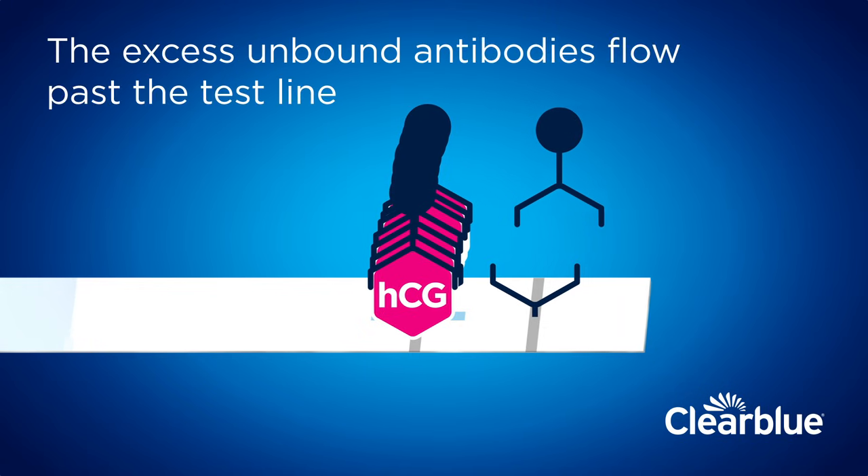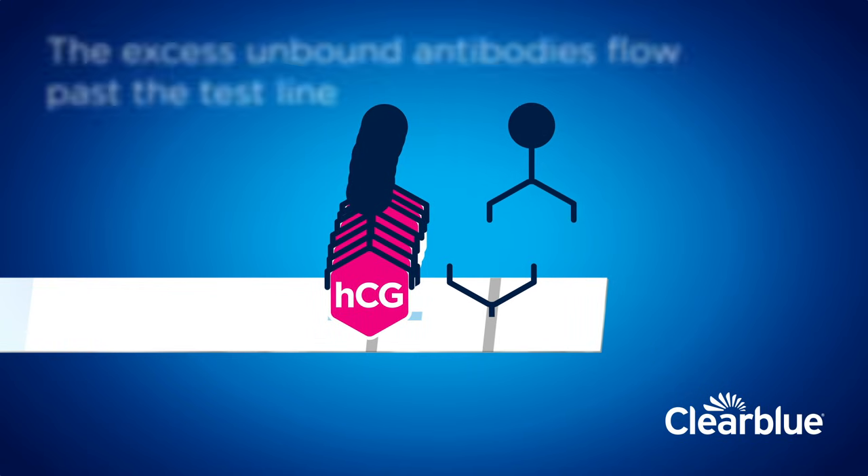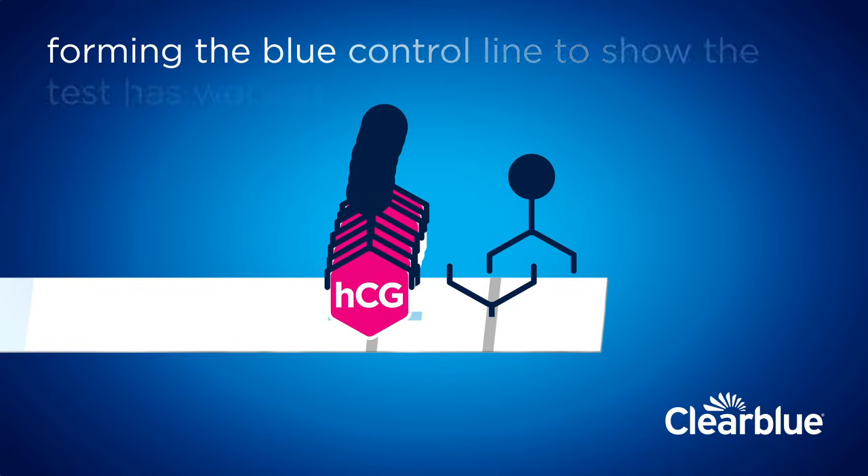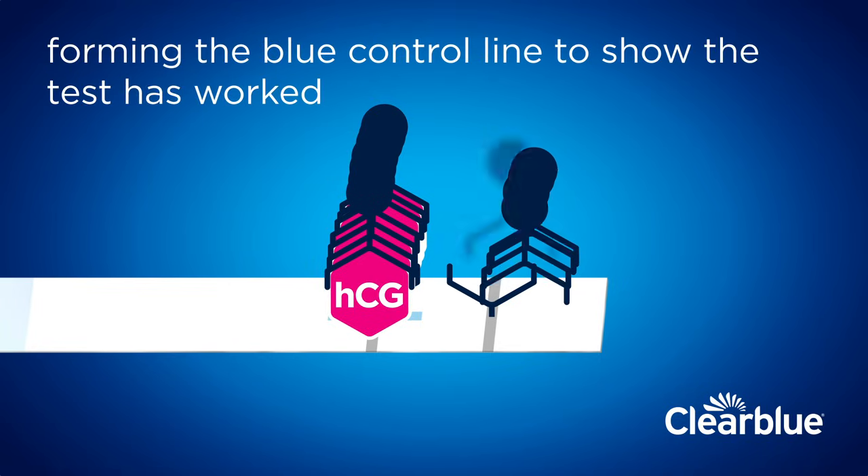The excess unbound antibodies flow past the test line and are captured at the second, control line zone, forming the blue control line to show the test has worked.